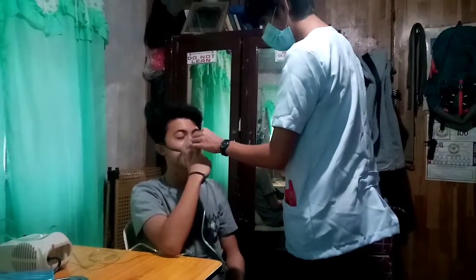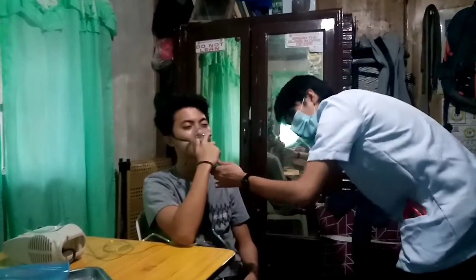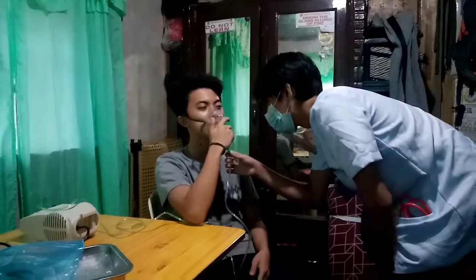Sir, we are now starting the aerosol, the medicine for your treatment. Remain with the patient until all solution has been nebulized. Instruct the client to continue the treatment until he or she can no longer see a mist on exhalation from the opposite end of the mouthpiece or vent holes in the mask.